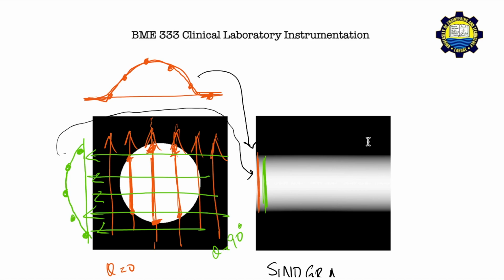Through this sinogram, we're able to reconstruct or get an idea of the shape of the original object. A sinogram for a circle would look something like this. A sinogram for different shapes would look something different, but for each projection profile that we get, there's corresponding image information that we can access, and therefore reconstruct based on that.